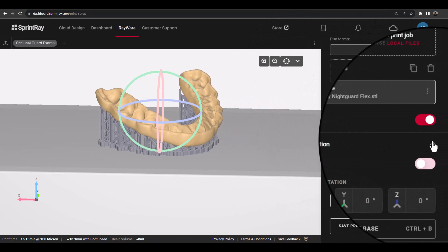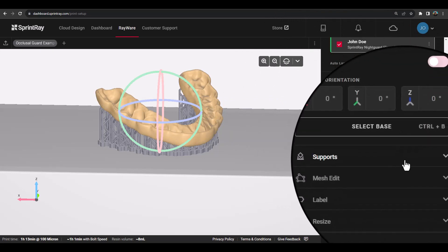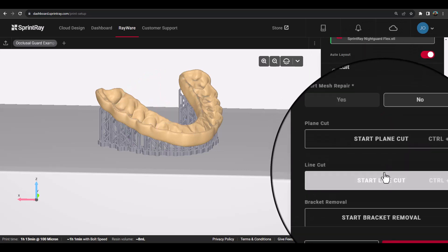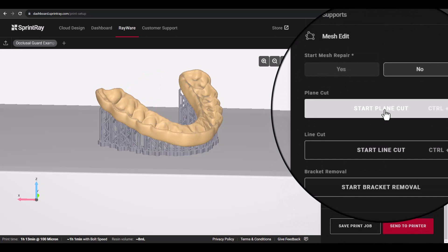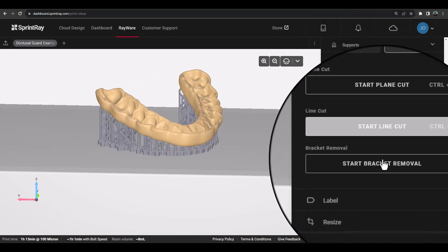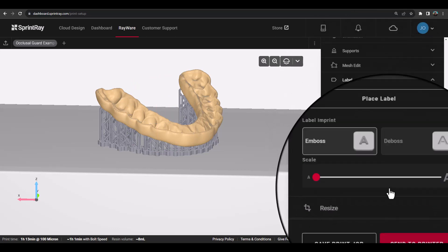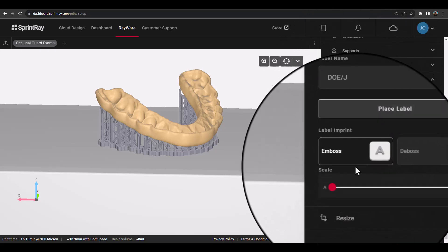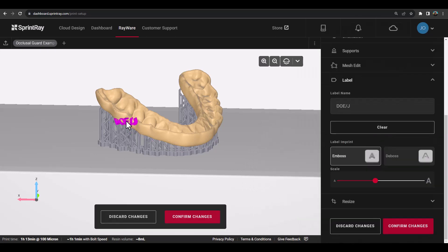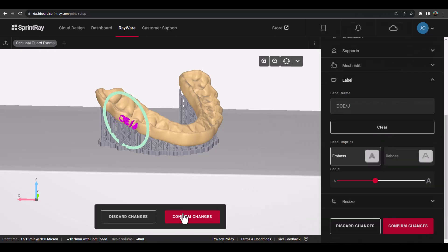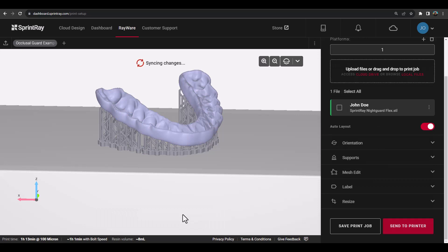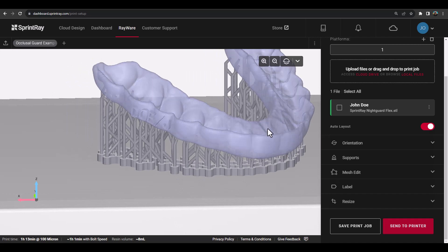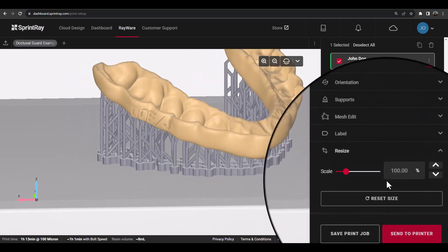When an STL file is selected from the list, you will have the ability to modify the orientation, supports, or do minor mesh editing, such as a plain cut or bracket removal, as well as useful tools like adding a label or resizing your model.